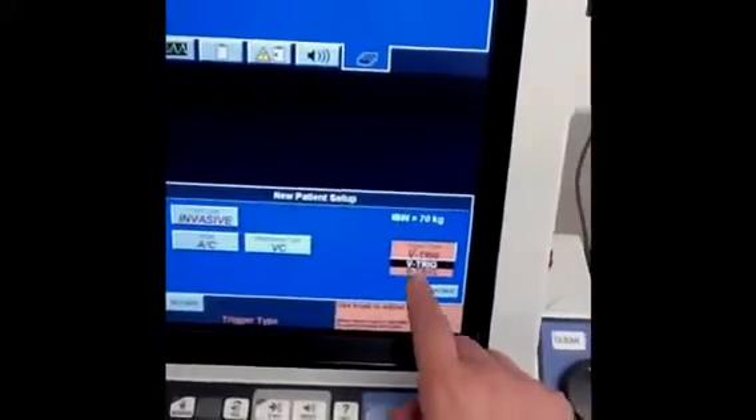We'll keep this in assist control. You can choose pressure control, volume control, or volume control plus — we'll keep it in volume control. You can also choose flow or pressure triggering; we'll keep it in flow triggering. Then hit continue.